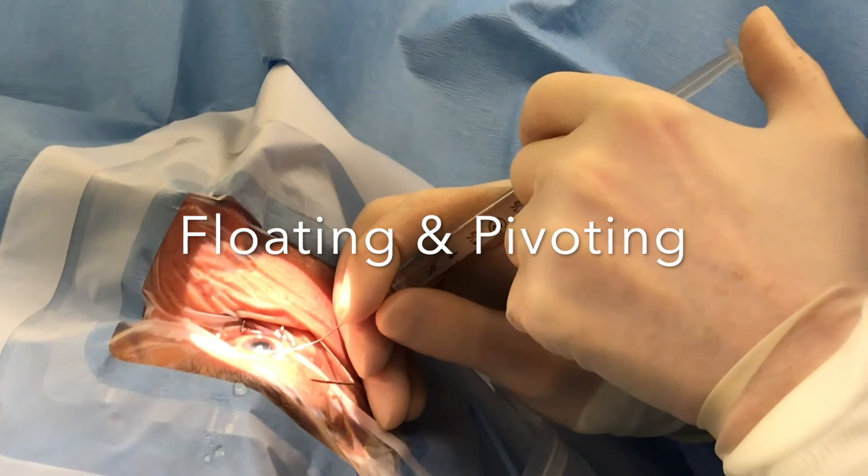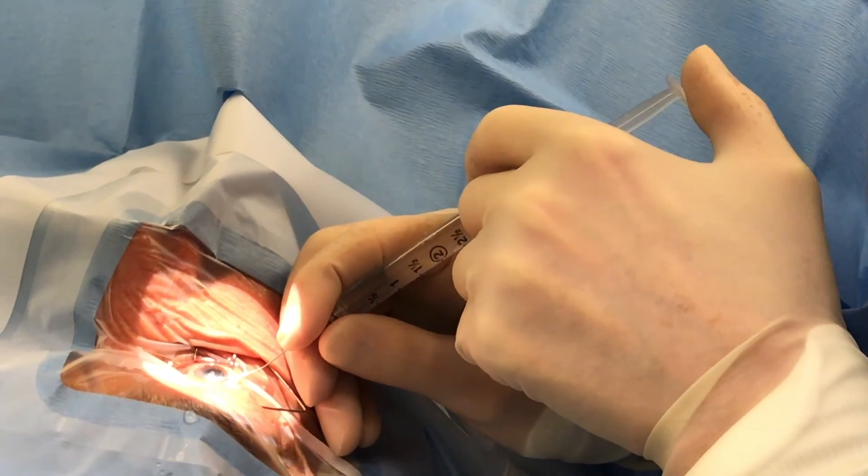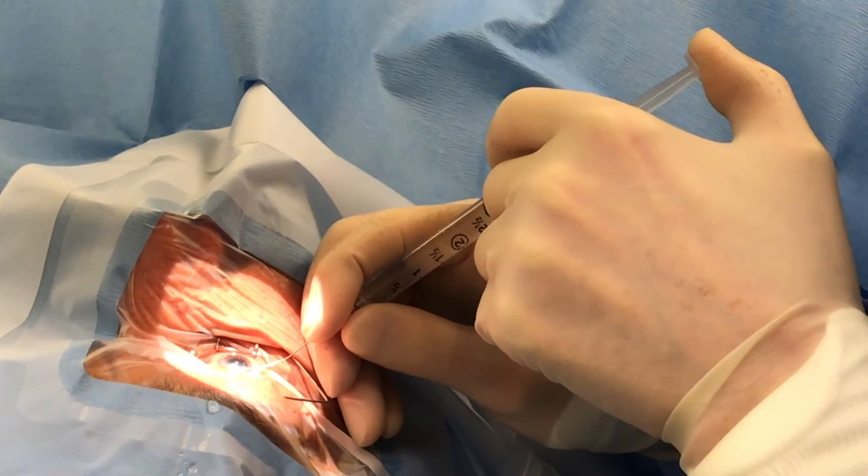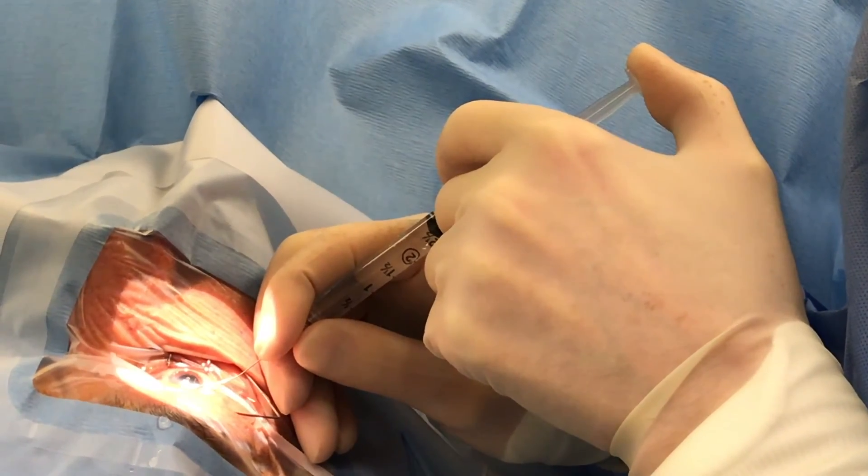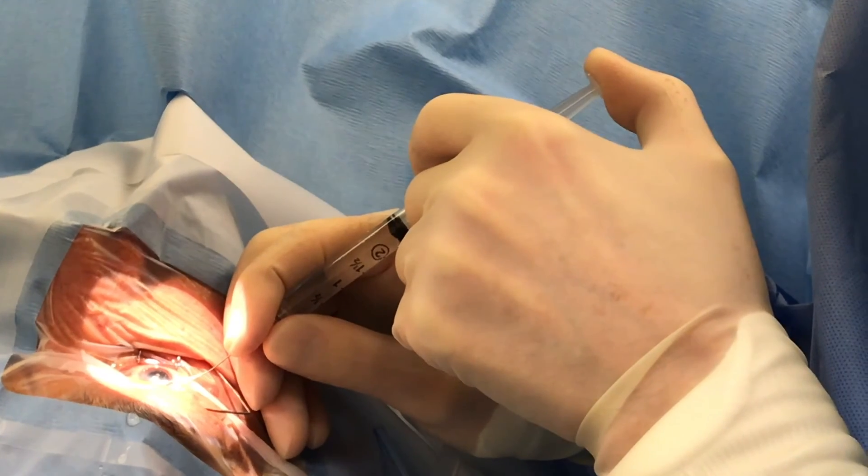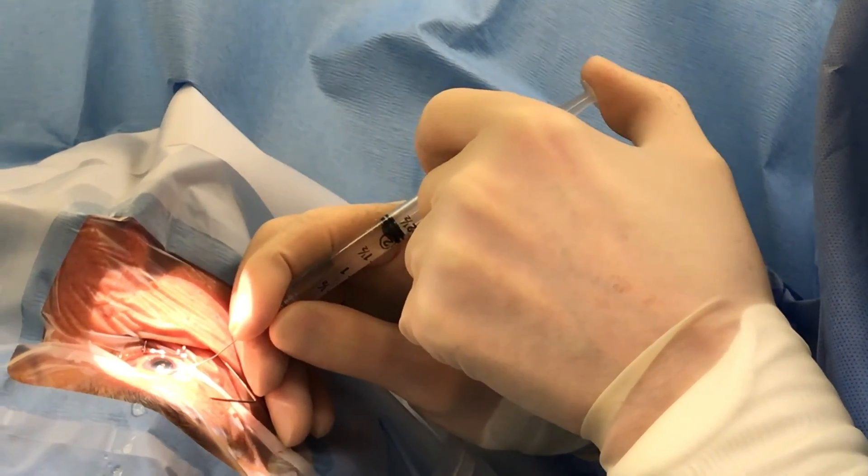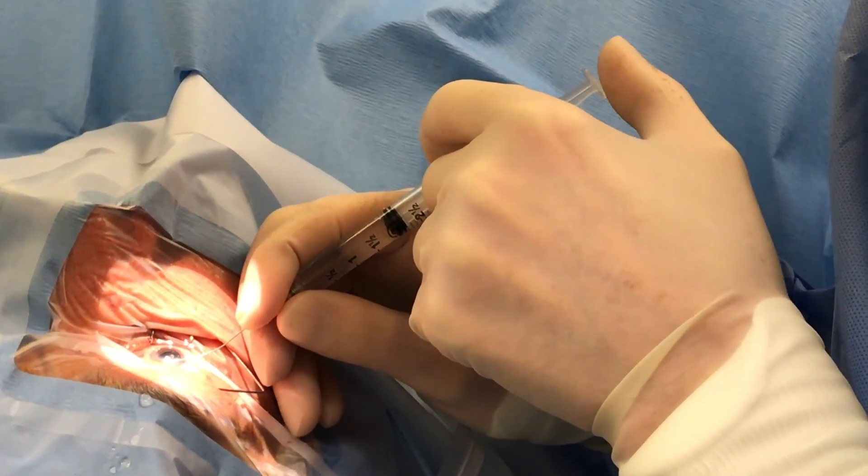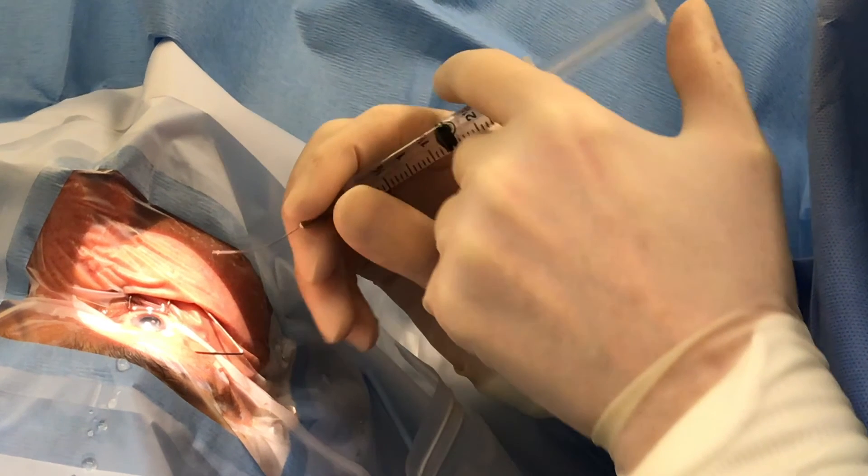Floating and pivoting in your entry sites is very important in anterior segment surgery. Avoid posterior pressure in the rapid pulse phase of injection, otherwise you're risking iris prolapse, so think about that. For maximum control of any instrument in the anterior chamber, always hold it like a pen when you have the opportunity to do so in your dominant hand, and do all your injecting with your non-dominant hand.